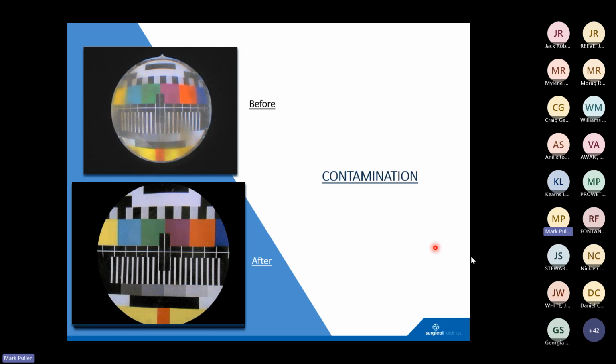The other side of it could be internal contamination, which is obviously a bigger problem. The contents of the endoscope are spring loaded. So when the scope is sterilized at high temperatures, this can cause the tubing to expand slightly. This expansion and retraction over time can cause particles to appear, and unfortunately it's unavoidable.